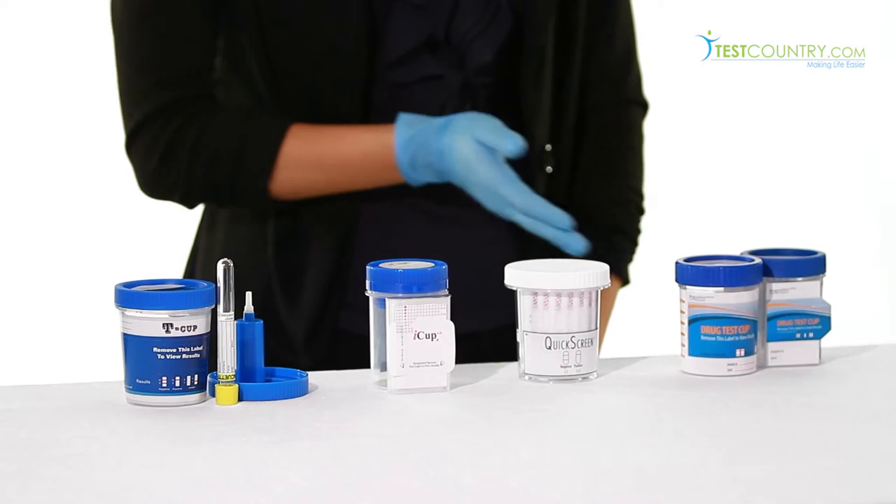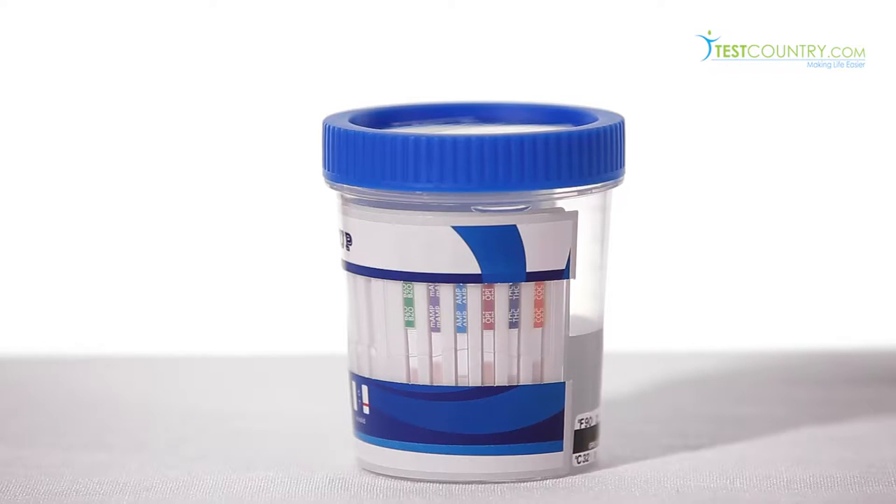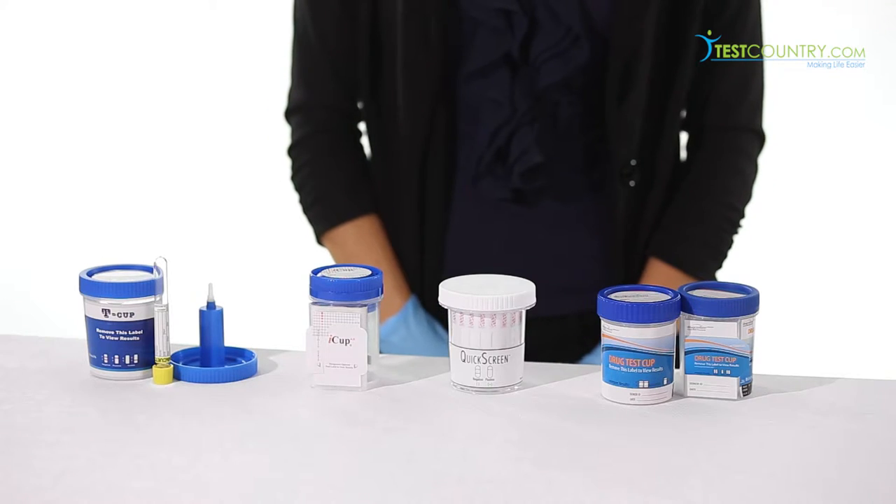Test Country offers a variety of cups with different key features. The TEACup offers any combination of drug testing from 5 to 14 different drugs, plus adulterants. It can be used with the vacutainer, which we cover in a separate video, and is CLIA waived and FDA approved.